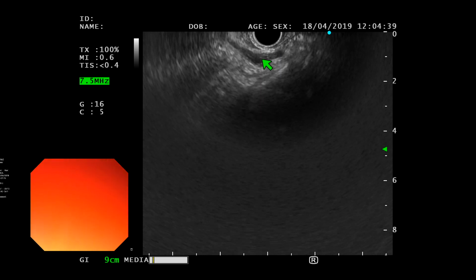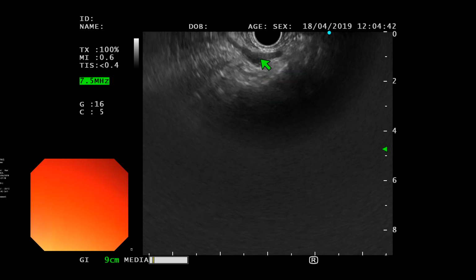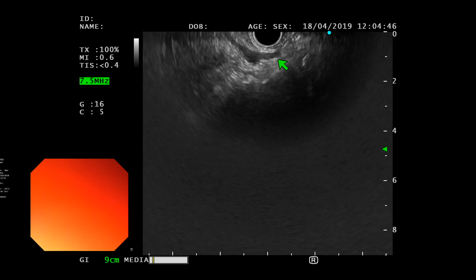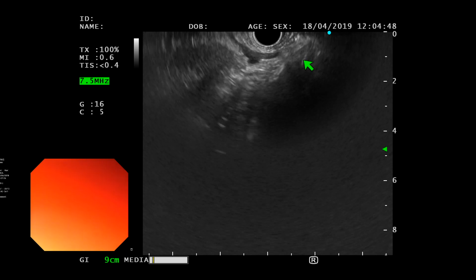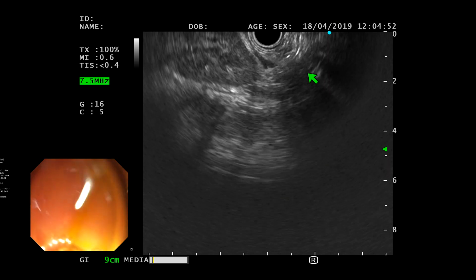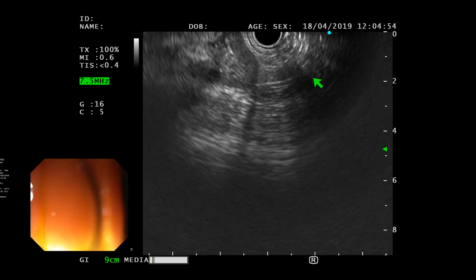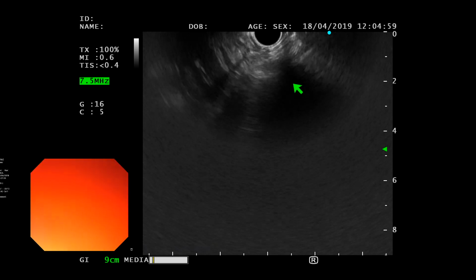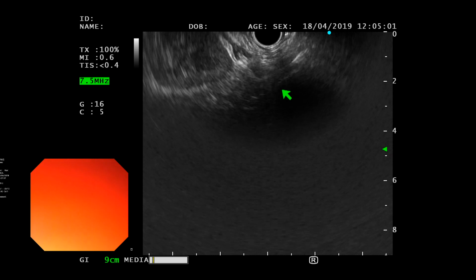See that? Okay. So you have the celiac. You go 90 degrees clockwise, you will get the left adrenal. The kidney will be here. Now if you keep going clockwise, there's the left kidney. Keep going clockwise, and maybe just pull back a tiny bit. Pull towards you, and go counter a bit. You should have the spleen somewhere here.